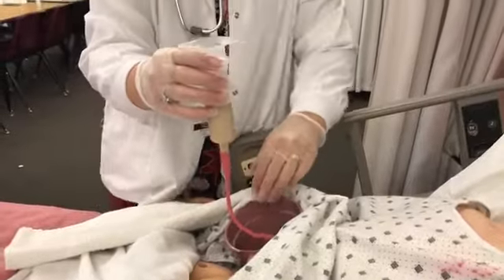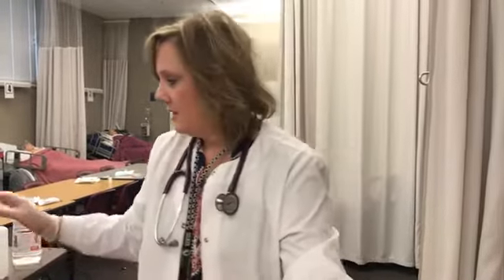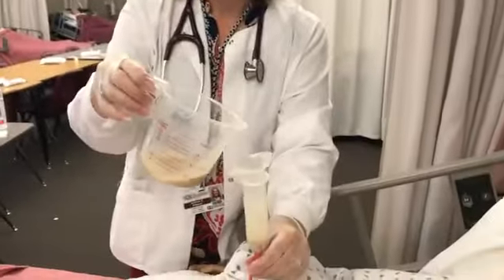Just to speed things up on the video. Okay, all right, so we've got the feeding. It's gone through, and now we'll need to flush with 50 cc. You will put the rest of your 100 cc's in here and let it go. Since this is quite thick with the equipment I'm using, I'm just going to speed up our video because I want you to get just the process of it.